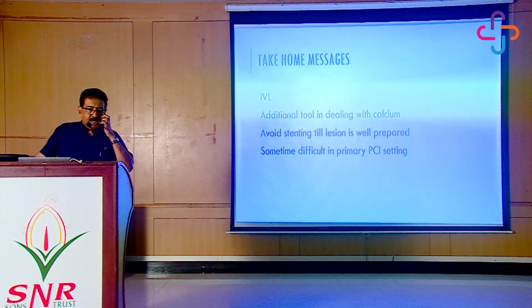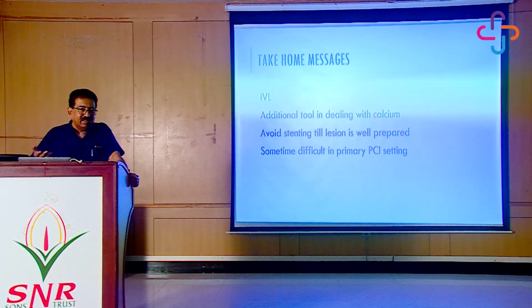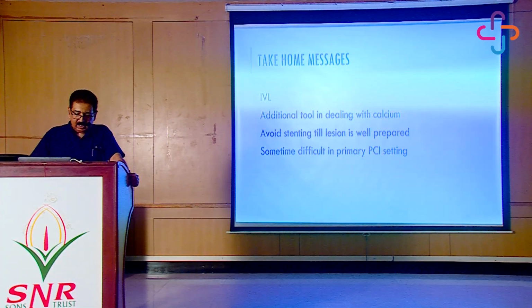So we get a lot of calcified lesions now with elderly populations. Unless we prepare the lesion well, if we under deploy the stent, we can end up with problems with stent thrombosis and restenosis. Hence we have all this array of tools like cutting balloon, rotablation, laser, intravascular lithotripsy. All of these help to break the calcium, prepare the vessel well, and help us to deploy the stent well.